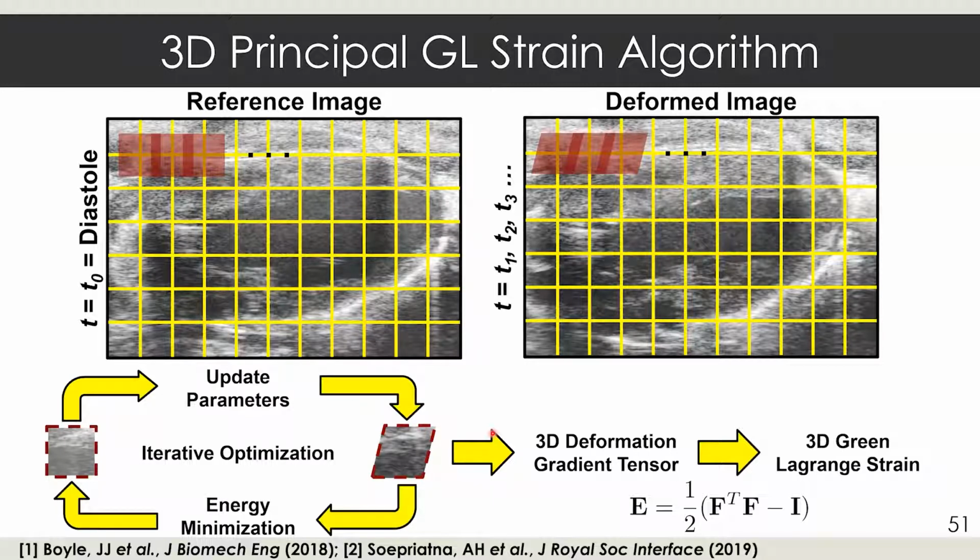So what we did is we used a low flow tabletop vaporizer called the SomnoSuite. And so we were able to deliver a much lower amount of isoflurane, even though we used kind of 3% that we somewhat slowly taper off throughout the imaging acquisition to try to maintain a constant heart rate throughout the 30 minutes of imaging. Using a tabletop low flow vaporizer really helped us get a consistent heart rate throughout imaging acquisition.